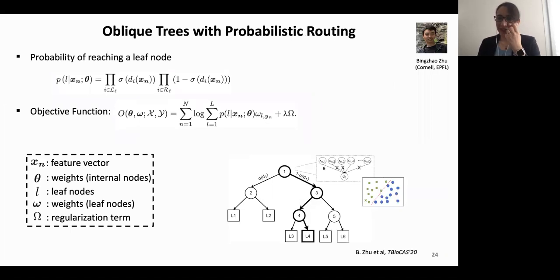But one challenge with this ensemble approach is that more difficult classification tasks may require a large number of trees to achieve a reasonable performance. For example, in the tremor detection task or in motor decoding, which are more complicated than seizure detection, we needed a higher number of trees, in the order of 30 or 50, which could increase the hardware complexity of our classifier and also the size of the model on the chip.